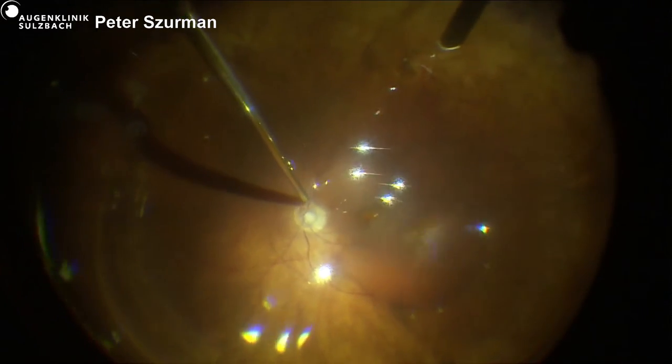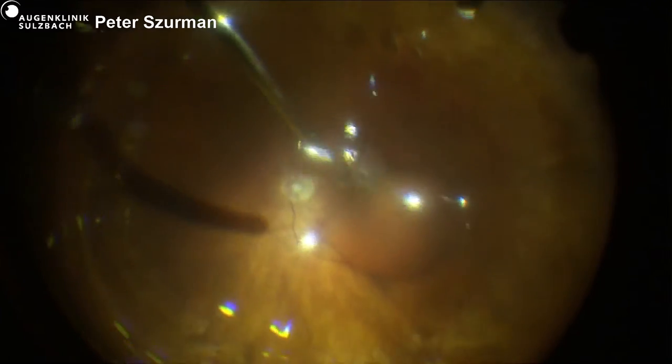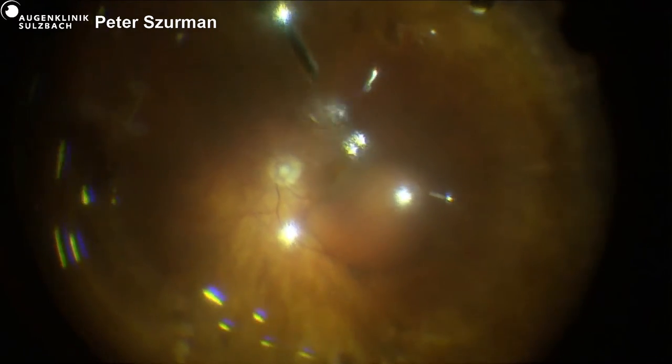the bleb formation will continue under the air pressure. So the patient will not lie in a prone position, but in a flat lying position to continue the bleb formation and the opening of the edges.